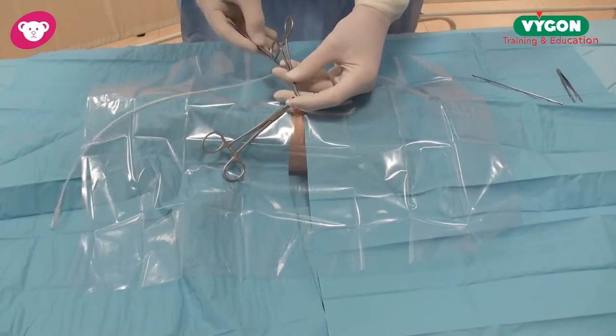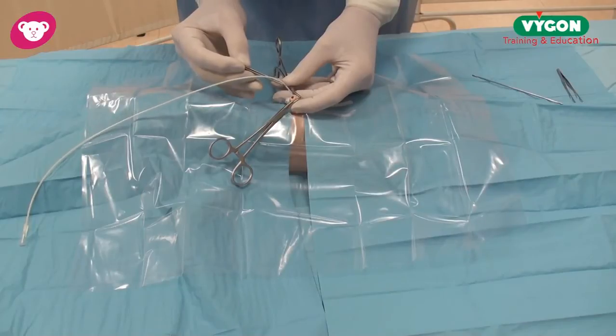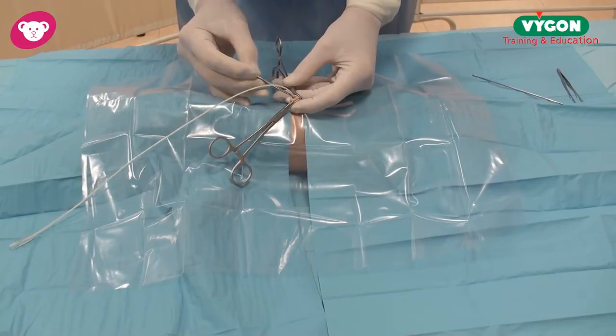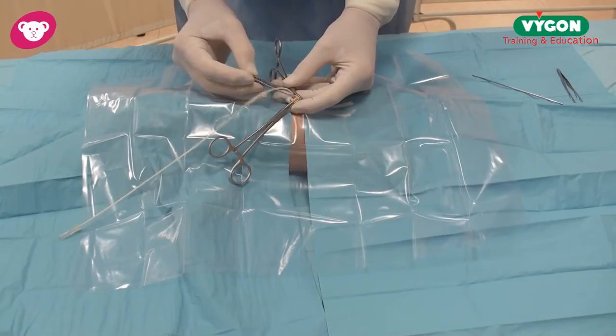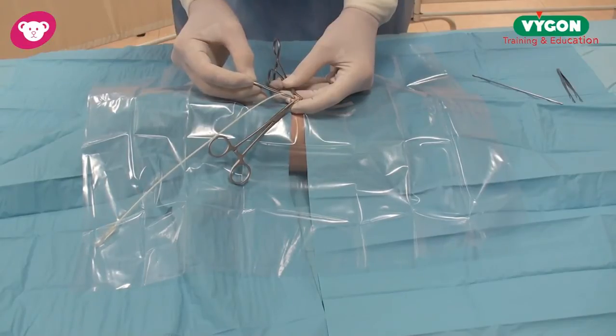You have the choice of forceps. Here I'm using straight forceps, but you've got also curved forceps if you require. Then place the catheter into the desired position. We've already pre-measured and used your local calculations for that. Once my catheter is in position, I will then connect up my saline.